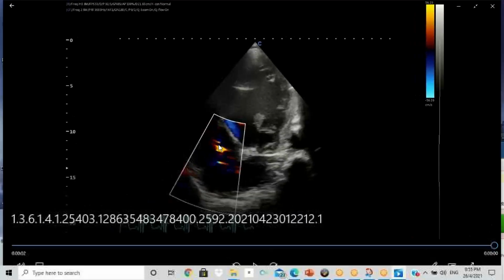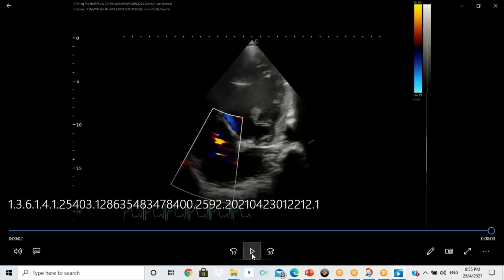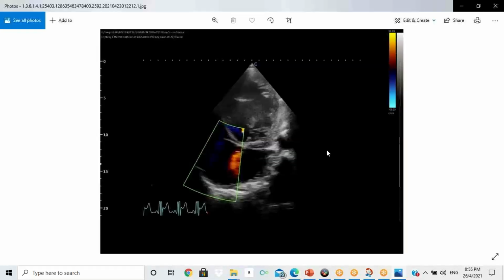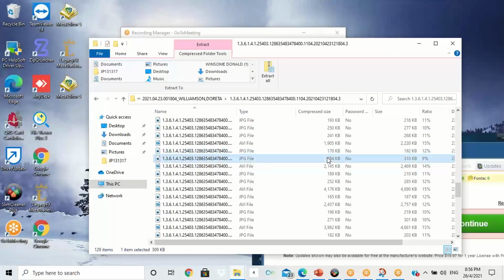And again, the color flows across the tricuspid valve. This is the TR right here. Okay. And we do the same thing. We're going to put the pulse wave Doppler across, sorry, the continuous wave Doppler across the tricuspid valve. We want to look at the tricuspid regurgitation. We use continuous wave Doppler because the velocity is usually more than 1.5 to 2 meters per second. So we use CW Doppler, continuous wave Doppler.